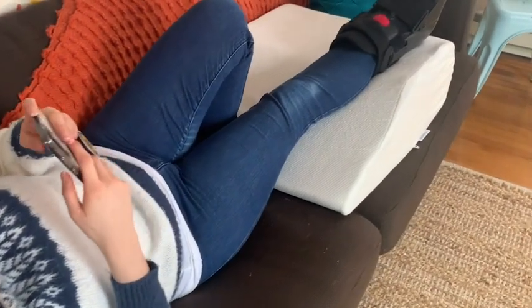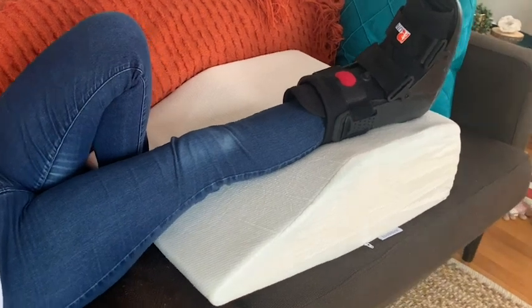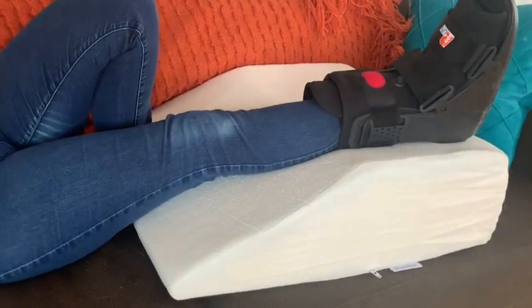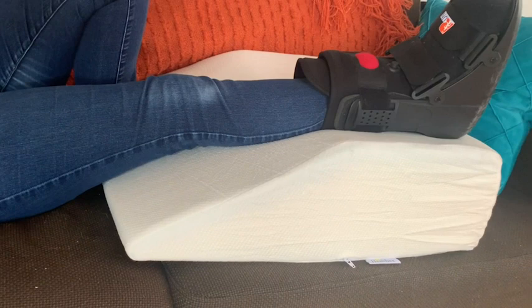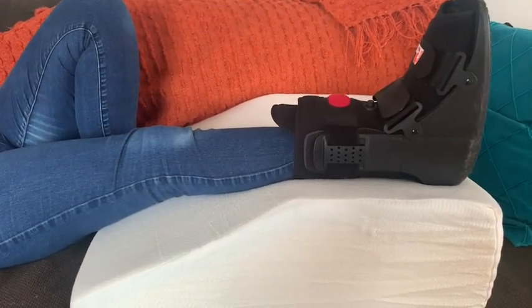Having a heavy cast or boot is uncomfortable and really weighs on the rest of your body. We were most excited that with this wedge you have that support and, most importantly, the comfort you need to rest and heal.